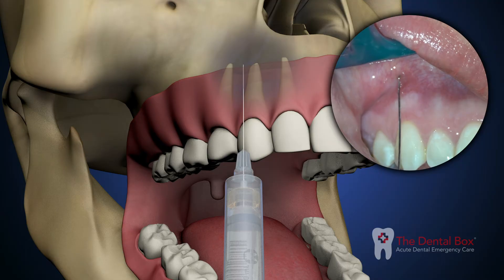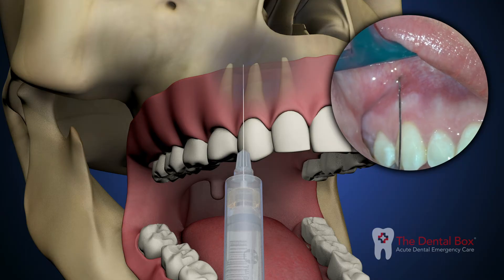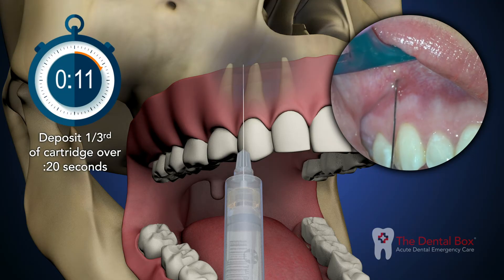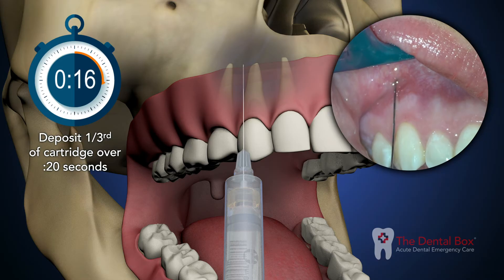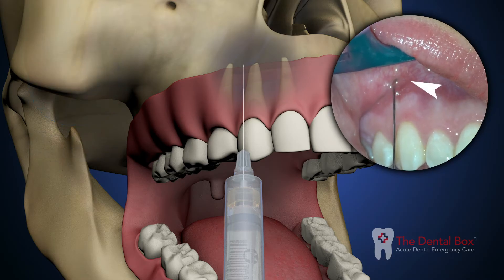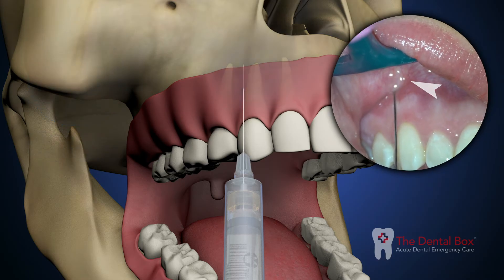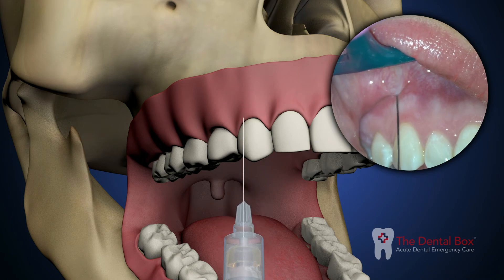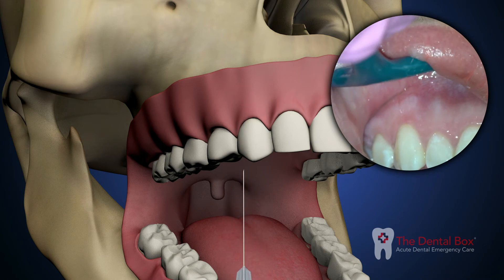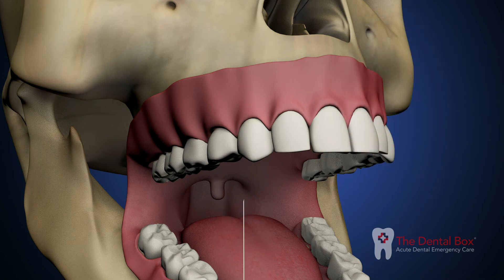Aspirate the syringe. If negative, deposit one-third of a cartridge over 20 seconds. Tissues at the injection site may balloon slightly. Withdraw the syringe and cap the needle. Pulpal and soft tissue anesthesia is achieved in about three to five minutes.